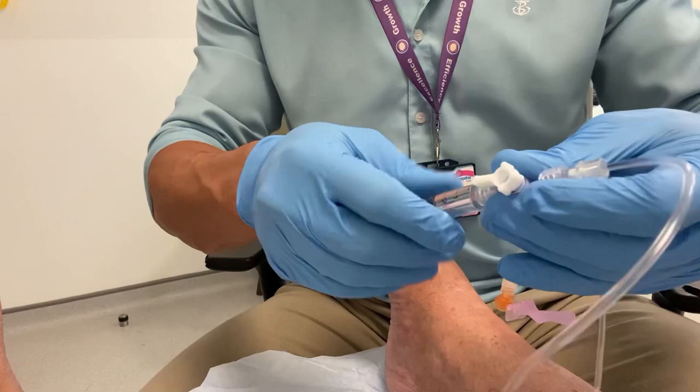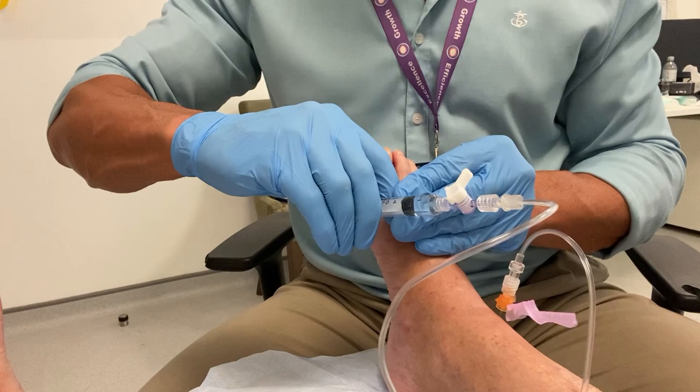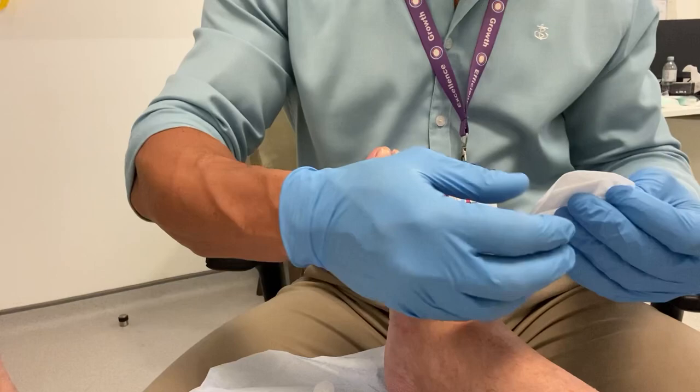I'm just flushing the line with some local anesthetic to make sure the hyaluronic acid is injected into the ankle joint. That is the first injection done in real time — minimal pain. I apply a dressing to that one and then we can begin with injection number two.